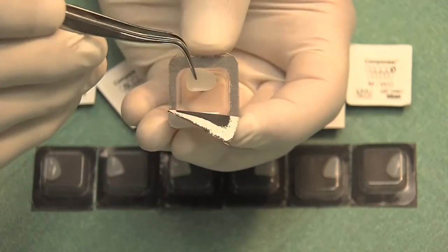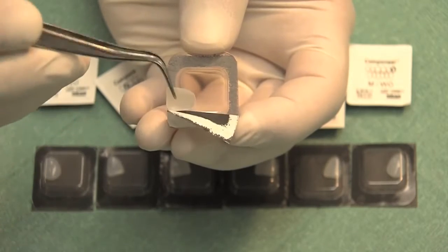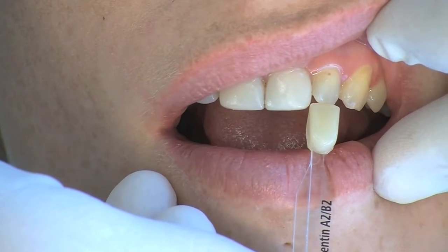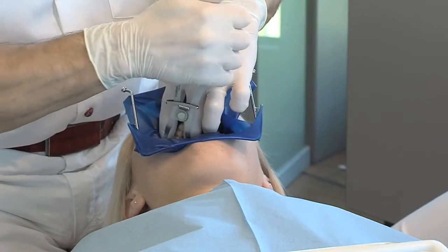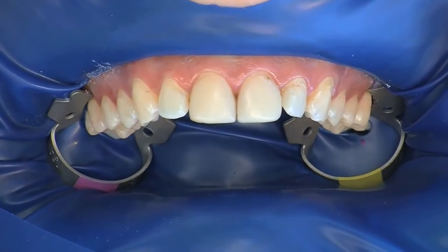The componeer is removed with a pair of tweezers. Before the preparation, the dentine and enamel shade are determined cervically and incisally respectively on the teeth using the shade guide. The prepared rubber dam is then placed over the dental arch and fixated distally by clamps.